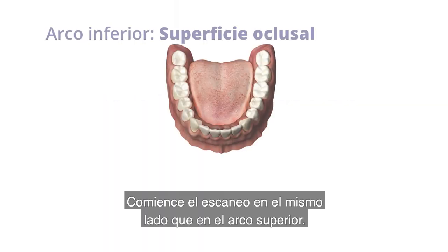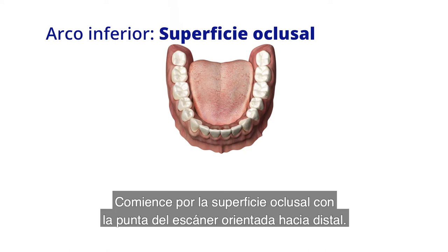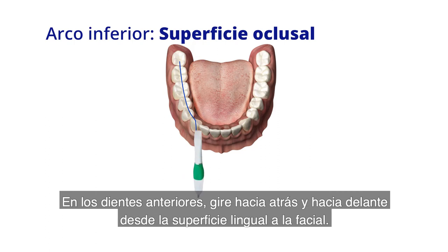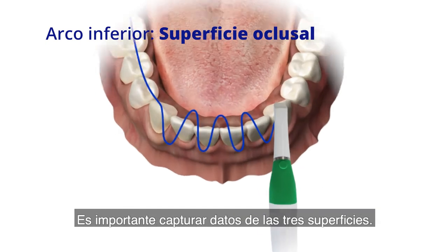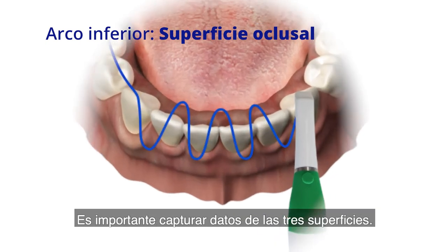Start scanning the lower arch on the same side as with the upper arch. Start from the occlusal surface with the tip of the scanner pointing towards the distal. On the interiors, rotate back and forth from the lingual to the facial. It is important to capture data on all three surfaces.